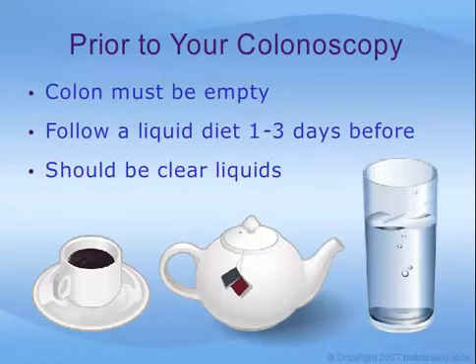To prepare for the colonoscopy, you will have to follow a liquid diet for 1 to 3 days prior to the colonoscopy. The liquid diet should be clear with no food colorings, and it may include fat-free bouillon or broth, strained fruit juice, water, plain coffee, plain tea, diet soda, or gelatin.